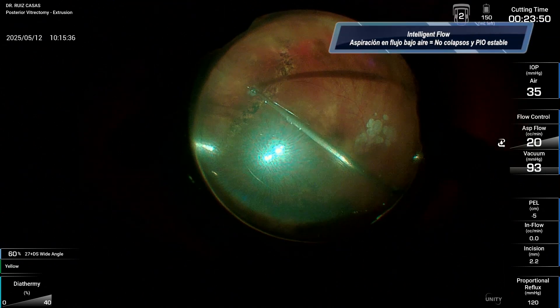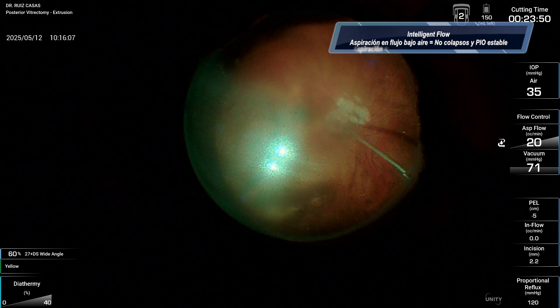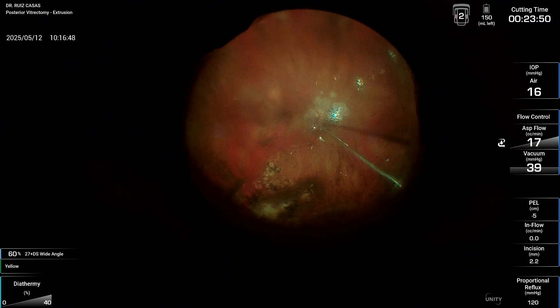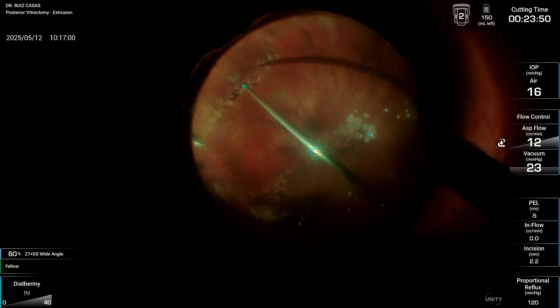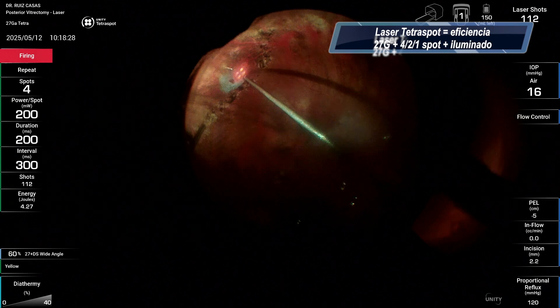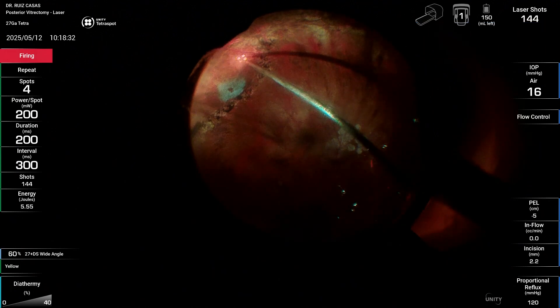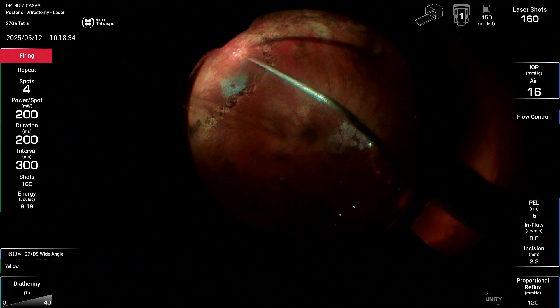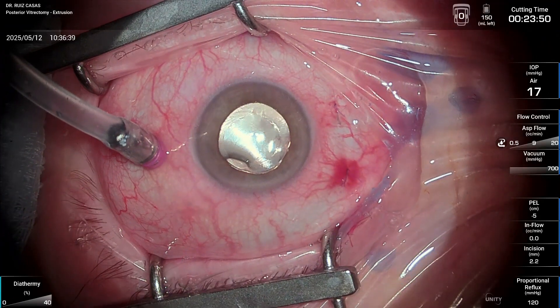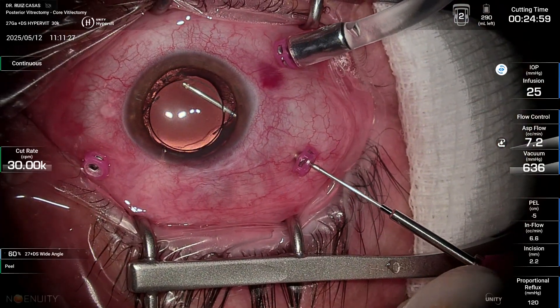Now I'm doing the fluid-air exchange using the peristaltic pump, although you can avoid problems with the peristaltic pump under air by using the venturi pump that is also built into the system. I'm using this tetraspot laser, which is awesome — it helps you to do laser very fast over a wide area. I finished using some PRP and fortunately in this case I didn't have to do any sutures, thanks to operating with 27G.